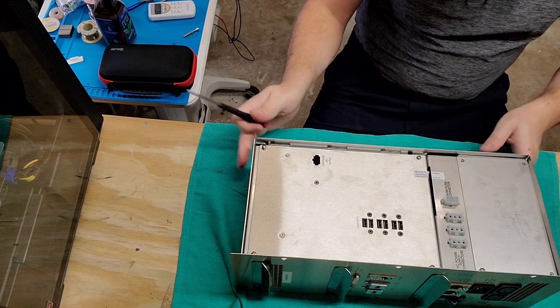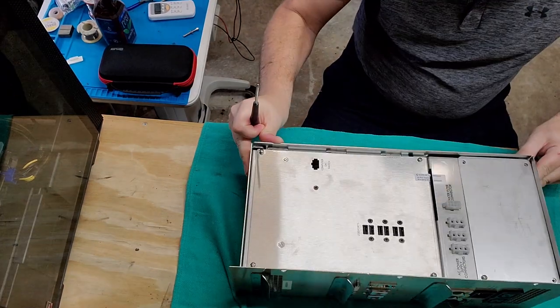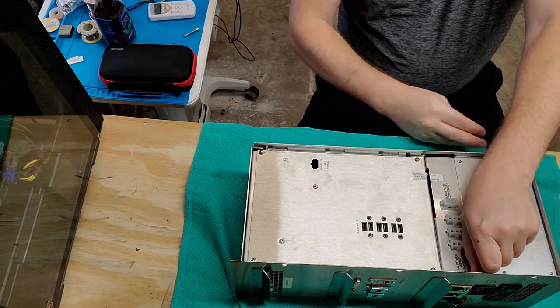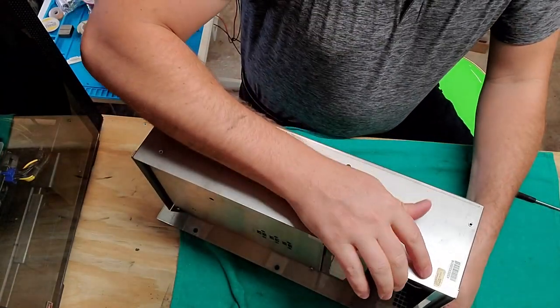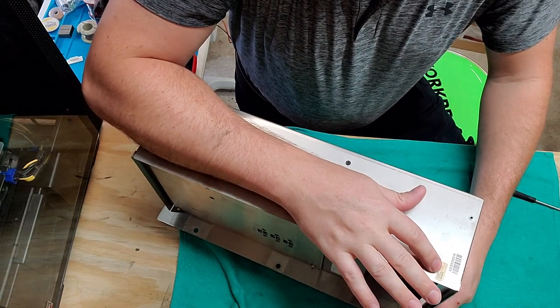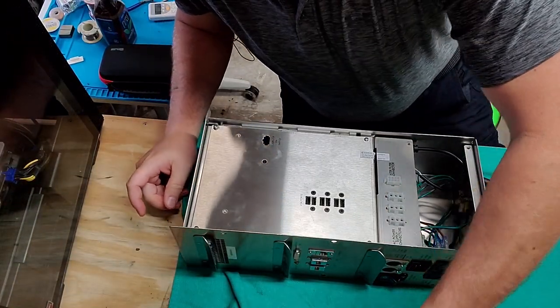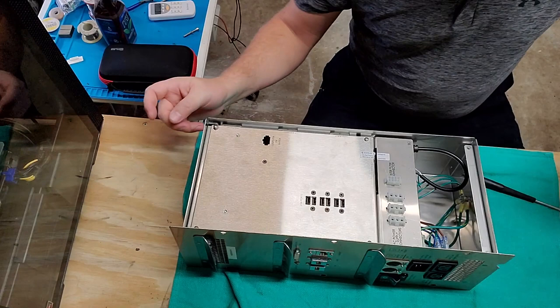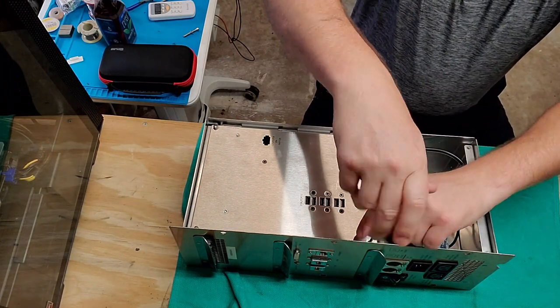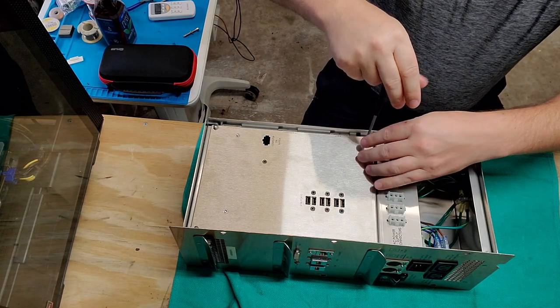It says it has Windows Embedded Standard. That's what the sticker says. Usually the Windows stickers, which is this little guy right here, a lot of medical equipment has these little Windows stickers, and that kind of gives you an age estimate for the device. But this one here, I'm just going to take a guess, because it doesn't say Windows XP Embedded or anything. It just says Windows Embedded. I always look for those stickers on a device that's a portable PC like this.